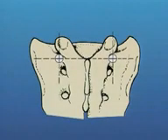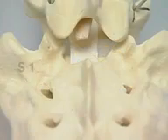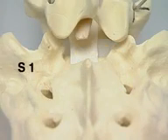The entry point for S1 pedicle screws is located at the intersection of a vertical line tangential to the lateral border of the S1 articular process and a horizontal line tangential to its inferior border. Ideally, the trajectory of the pedicle screws converge towards the midline, but the overhanging pelvis may limit this in vivo. The screws should aim at the anterior corner of the sacral promontory. It is important to identify and avoid the S1 foramen.